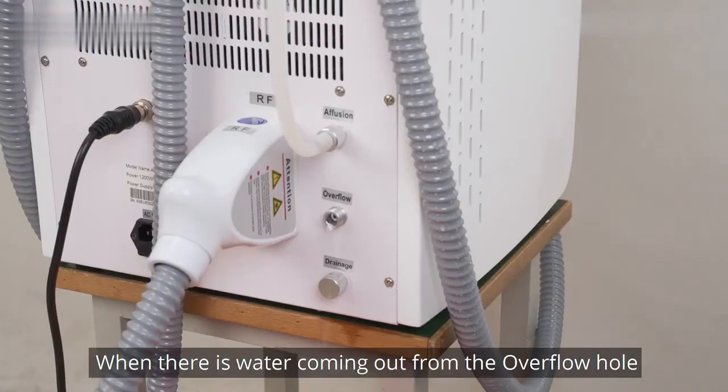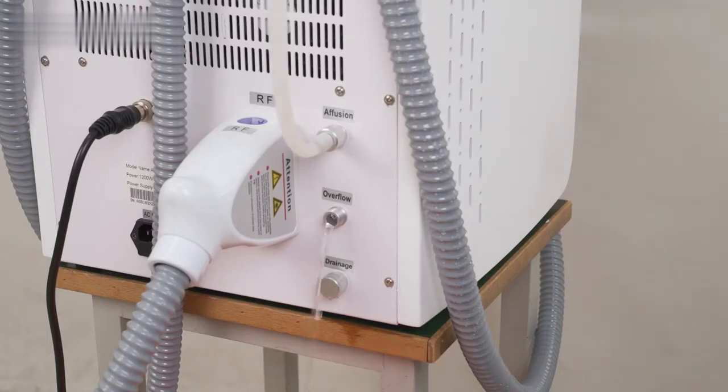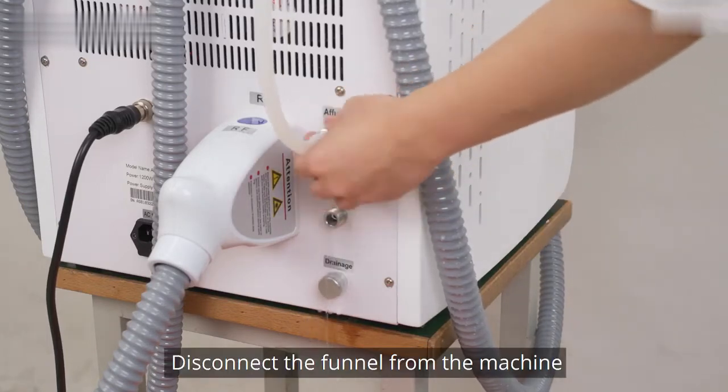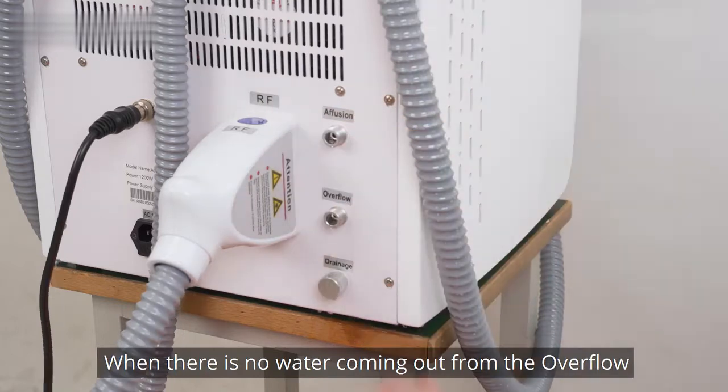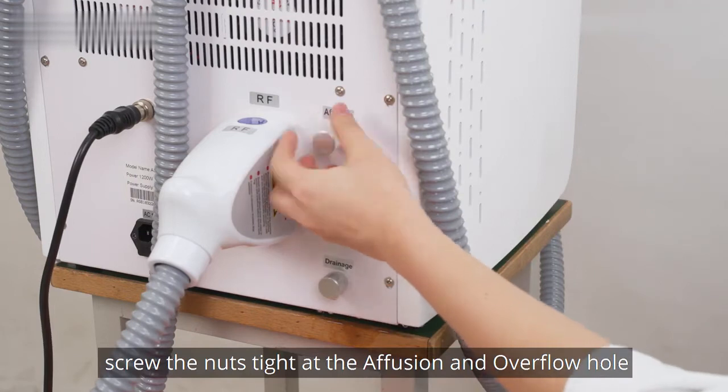When there is water coming out from the overflow hole, the water inside the machine is enough. Disconnect the funnel from the machine. When no water is coming out from the overflow, screw the nuts tight at the infusion and overflow holes.